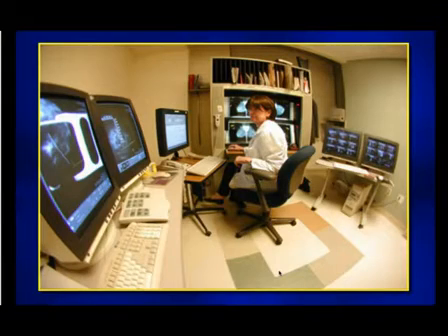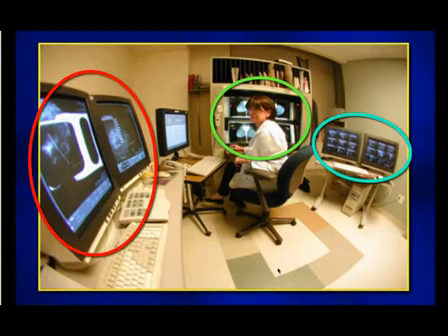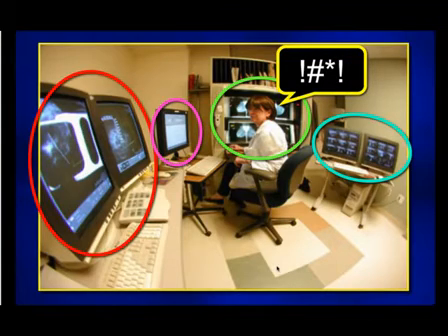And we're very fortunate in our department not to look like this. This is Gillian Newstead from the University of Chicago, and she sent me this slide a couple of years ago showing what she was dealing with in her department at the University of Chicago. Here was her PACS with the workstation for the mammography, showing the images here. And right behind her, you can see that there are these non-digitized analog films still on the multi-viewer for display, totally on the other side of the room. How do you compare that with the one on the left? Very difficult. Not only that, here's her ultrasound way over here, totally different workstation. And here is her RIS system and the keyboard for that way over here.